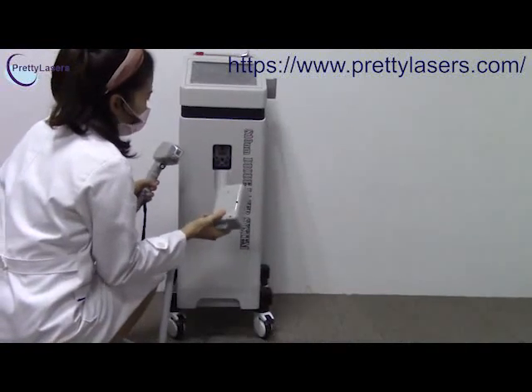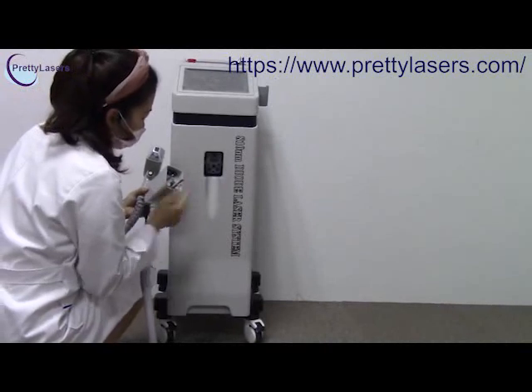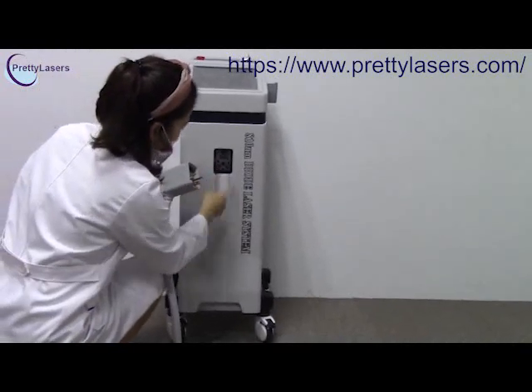Now we install the working handle. Before installation, you have to make sure these three tips match to the hole.